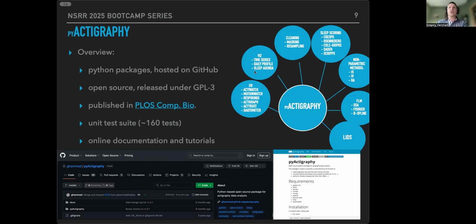There is a visualization submodule that would definitely need more work. I'm not really an expert in visualization, and I tend to calculate things more than visualize things, but it's definitely useful. So that's also a good thing. If people are willing to help, that would be a nice package that actually needs to be expanded.